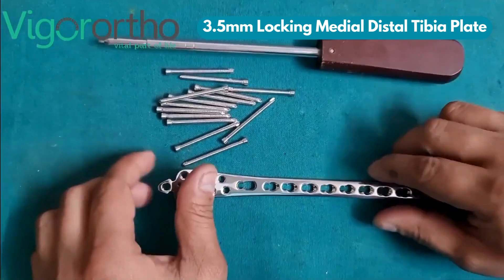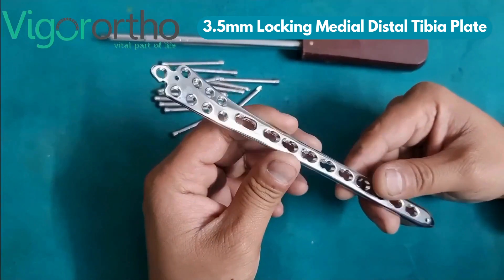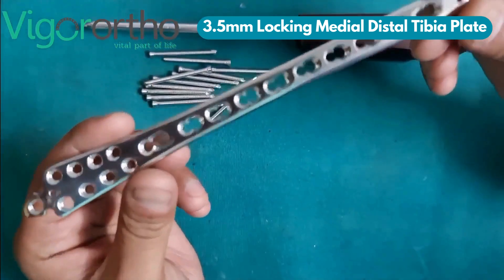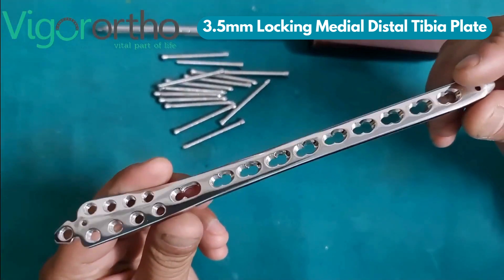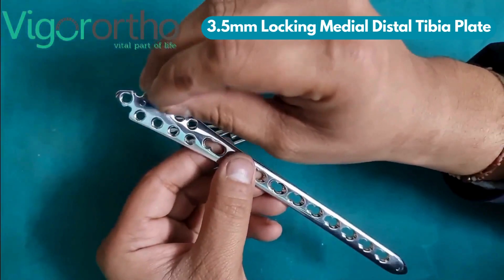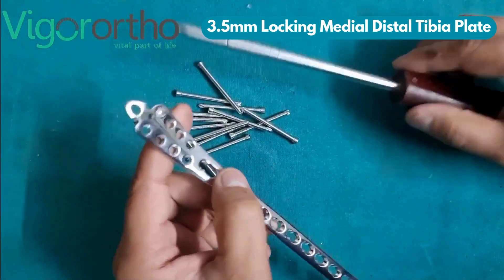A 3.5mm locking medial distal tibia plate is a specialized orthopedic implant used in the surgical treatment of fractures in the distal, lower part of the tibia, particularly near the ankle joint. Typically made from high-quality titanium or stainless steel, ensuring strength, durability, and biocompatibility.